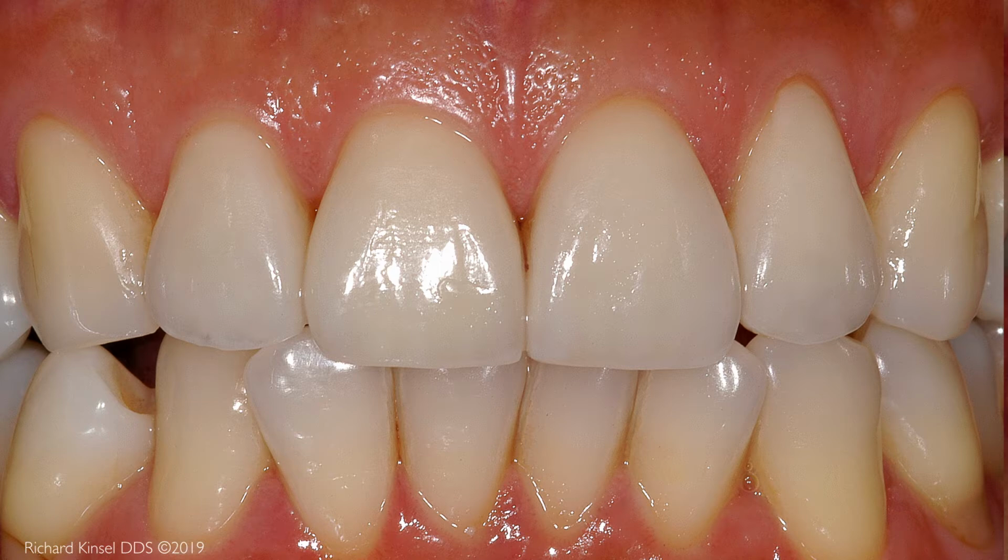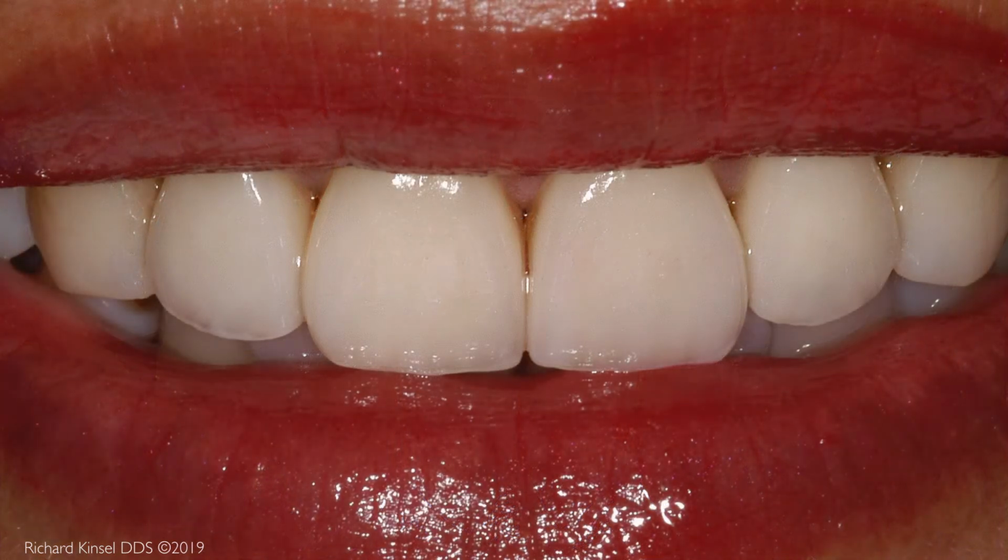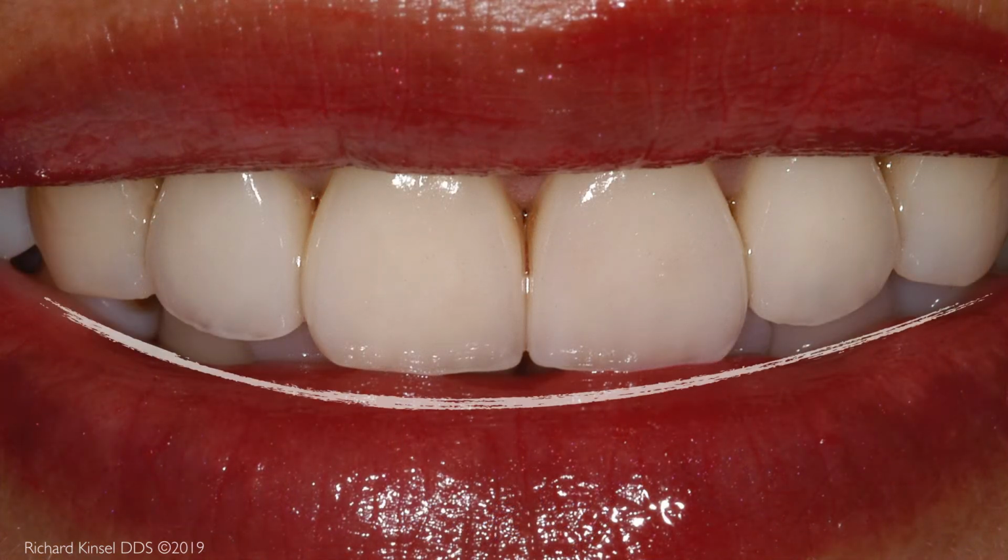These are the final 4 porcelain crowns. The open area near the gums has closed. The smile meets the optimal aesthetics of proper tooth display and incisal edges that follow the outline of the lower lip.